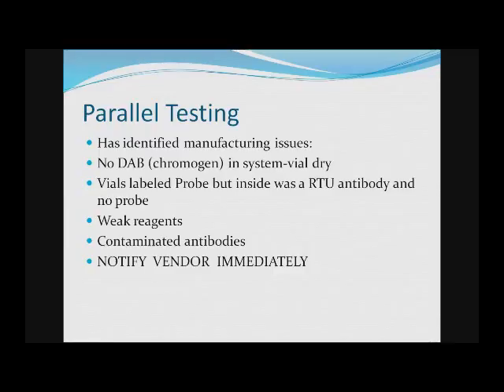There's no perfect anything. In today's world, we have lots of variances. It could be that something happened, something froze in shipment, maybe it overheated, maybe it sat on the dock in the sun, and we just need to keep ahead of all of these things. So don't get angry at the vendor and don't get angry at your coworkers. Notify the vendor and let them worry about what and how. They just need to send you a new item.